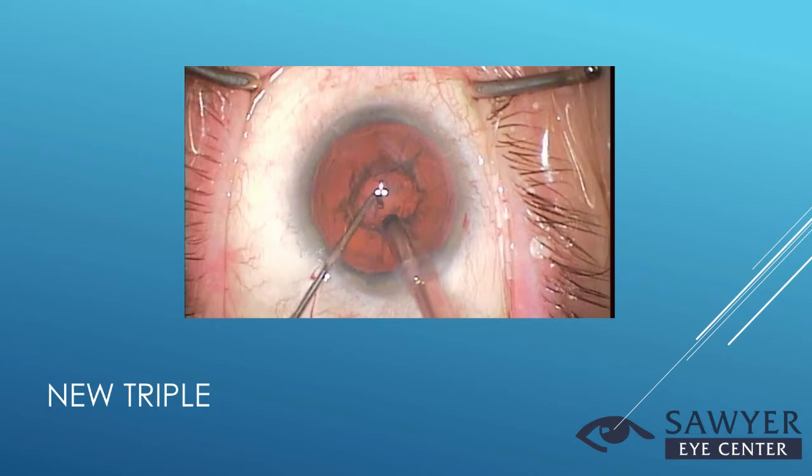And now we're dancing with the cornea. This is where we press on the outside of the cornea in different ways, little flicks, little presses, to send fluid waves inside the cornea to unroll the graft. The graft is endothelial side out, so if you touch it, you're going to touch the endothelium. So now I've unrolled it, I'm trying to center it. Now I'm cussing in my head for going a little too far and scrolling it back up. Get it unwound again, and I'm going to do a little press suction to move it into the center of the cornea.